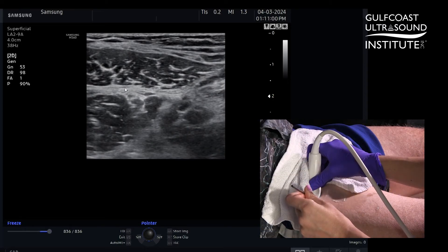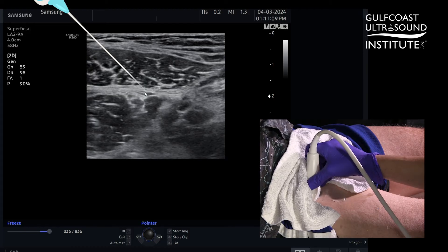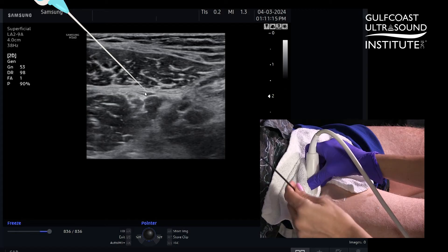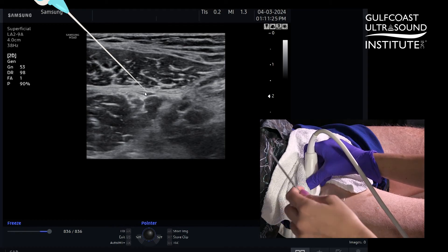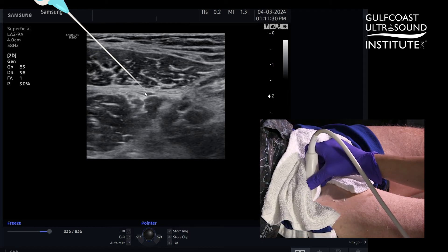Your in-plane technique trajectory is lateral to medial. You should be able to visualize the long axis of your needle coming in. As soon as you feel a pop underneath that fascial plane, you'll deliver one to two cc's of either normal saline to hydrodissect or your preferred anesthetic. As you see the anesthetic or normal saline unzip that fascial plane, you'll know that you're in the right place.